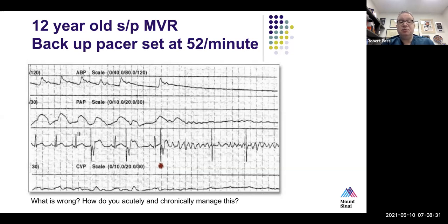If you're in an intensive care unit, presumably someone monitoring the patient at the bedside would be able to make the determination to turn the pacemaker on or not at the appropriate times, if there was no way to achieve proper sensing. But this is a nice example of how important it is to properly sense when thinking about a temporary or regular pacemaker. I might also add that this is one of the reasons why I do not love this rule that we have in the ICU sometimes to check all wires after a patient has come back from the operating room. Although I understand well the potential benefit of doing this, if you're not careful, you could just asynchronously pace the ventricle at the wrong time and cause a serious problem like this. And I'm always worried that that could happen.